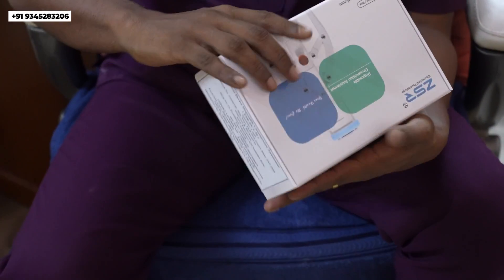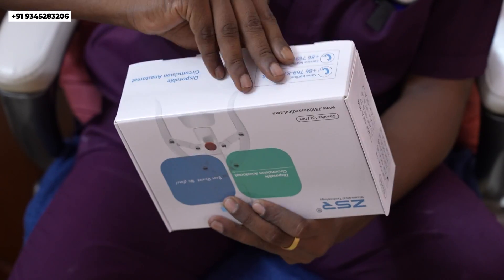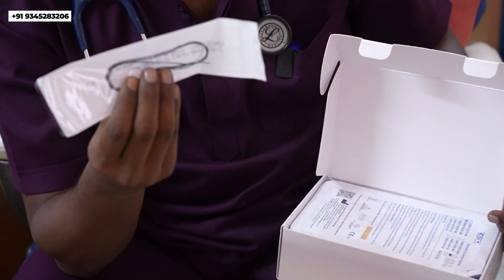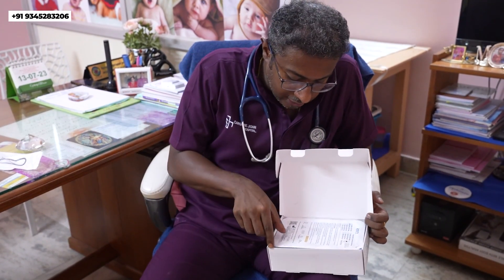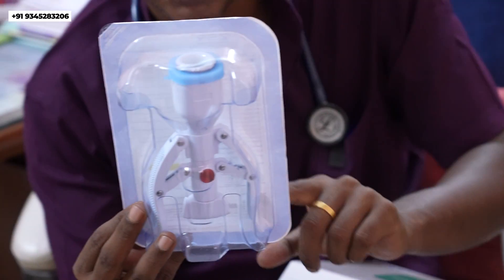I'm going to unbox the device now. This is the device, and this is the free tie, which we tie at the tip of the foreskin for the ZSR stapler to be held in place. This device is a one-time use, disposable device.